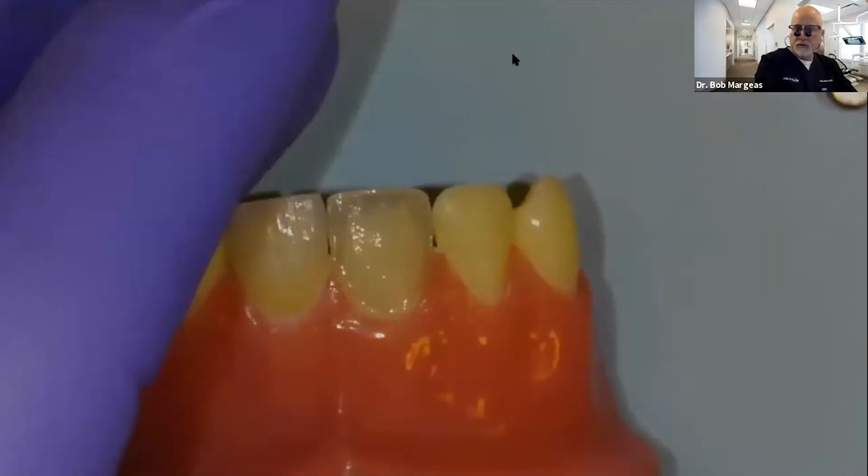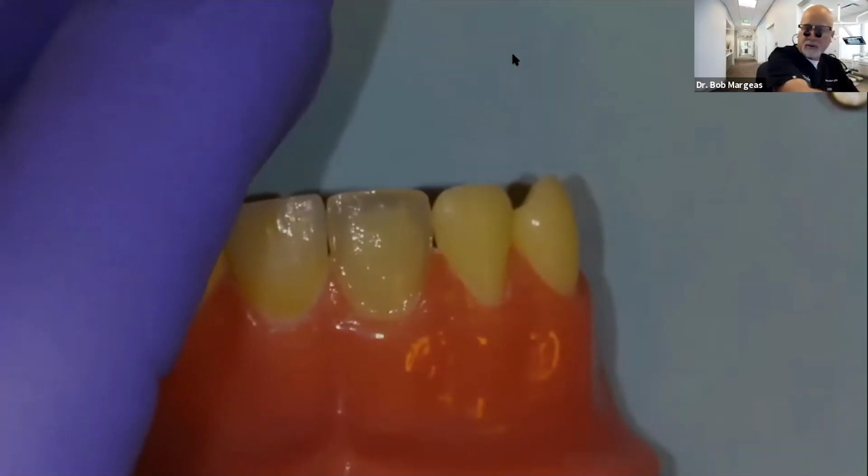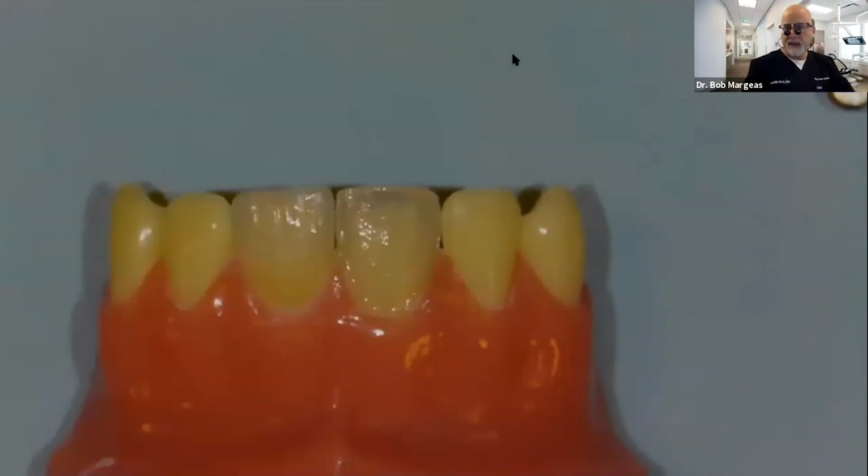Today I'm using the Velo light. This is from Ultradent. Very, very nice light. I like the new light by Ivoclar. The technology in the Ivoclar light is very, very nice because if you ever pull it back or you're off the tooth, it will vibrate and it will add time because you're too far away. And sometimes your assistants don't keep that light necessarily on the tooth. And so I think that's some nice technology. One thing is you really need to have a good curing light.